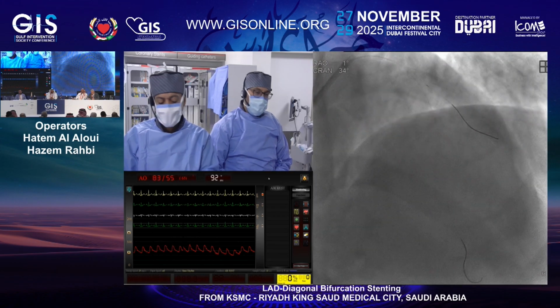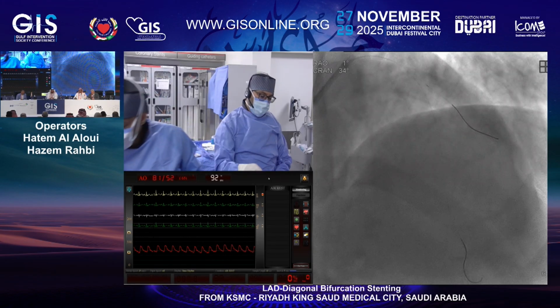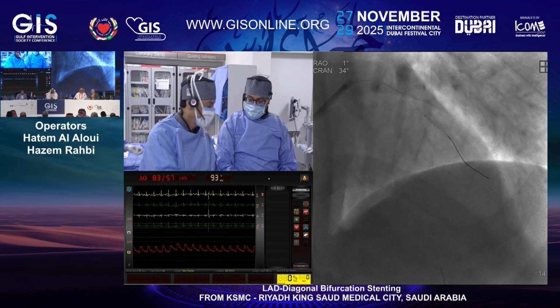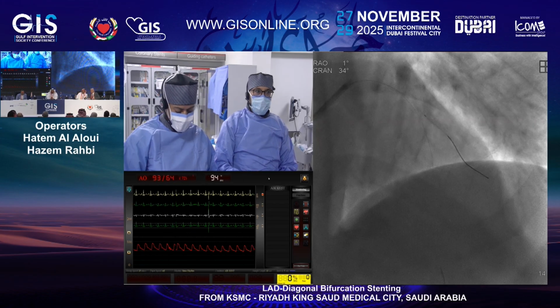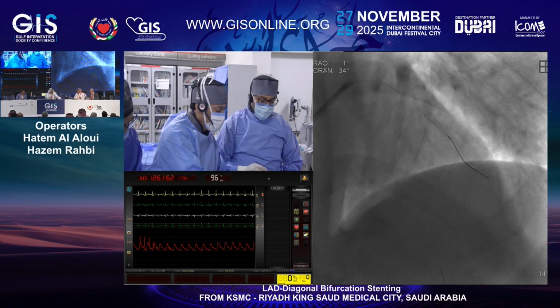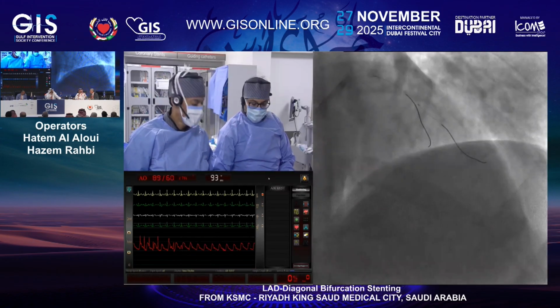Yeah, 150. Okay, let's take an NC balloon. Are you going with a short stent or a long stent? I would start with a short stent, honestly. First we'll use the briefest one. What's your thought here? Should we go with the long stenting, or should we stop at the proximal and leave it without a stent and look at whether we need to stent to have the drug eluting? No, not the diagonal. Which one? The LAD. We will use the cutting balloon again. Give me the wire.